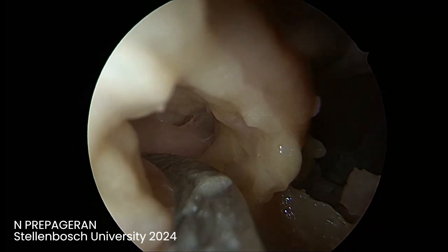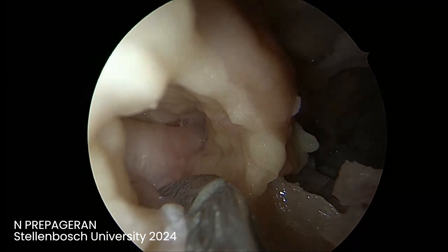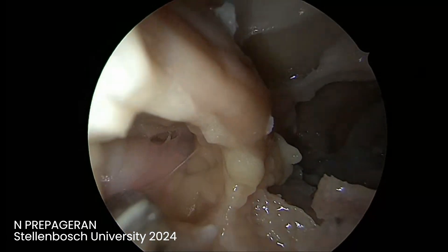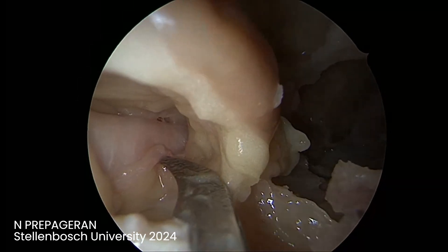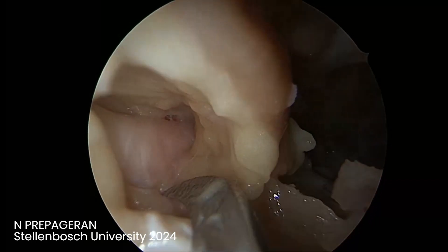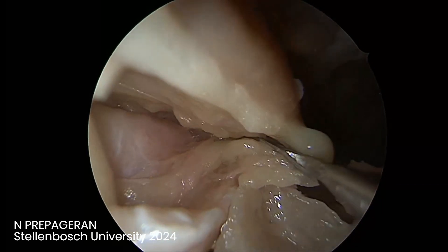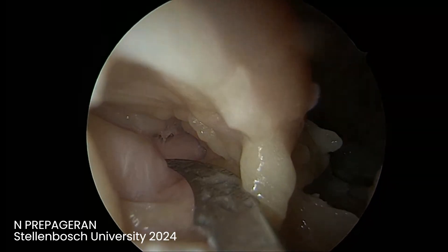Can you see there is a lining right here? If you remove this perineurium — and inferiorly is your ophthalmic artery — you have to be very careful when you dissect. These are the branches of the ophthalmic artery. As long as you respect the artery, keep it far away, keep the perineurium intact and the membrane over it, you can actually go all the way above the optic nerve to the other side as well.